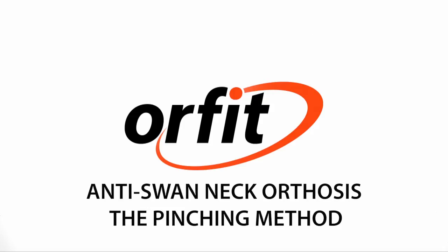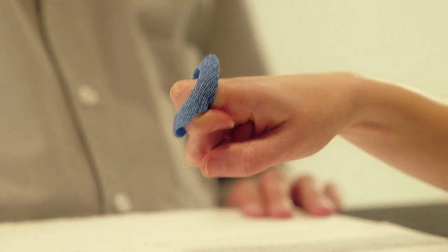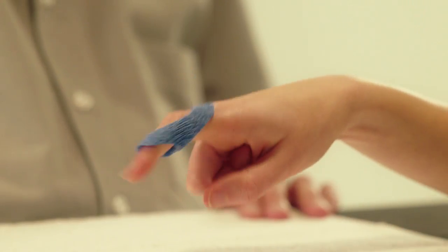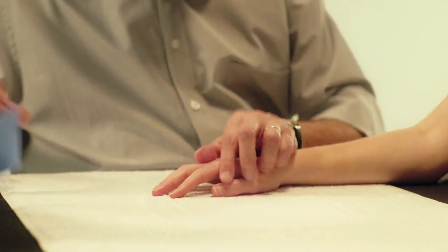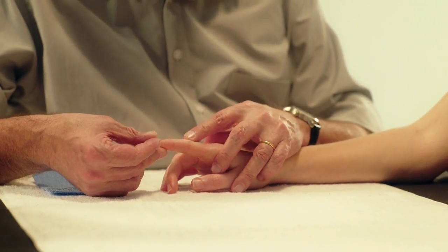Anti-swan neck orthosis using the pinching method. Here we will demonstrate how to fabricate an orthosis to prevent hyperextension of the PIP joint, also known as the swan neck deformity. The purpose is to prevent hyperextension of the PIP joint in the swan neck deformity.